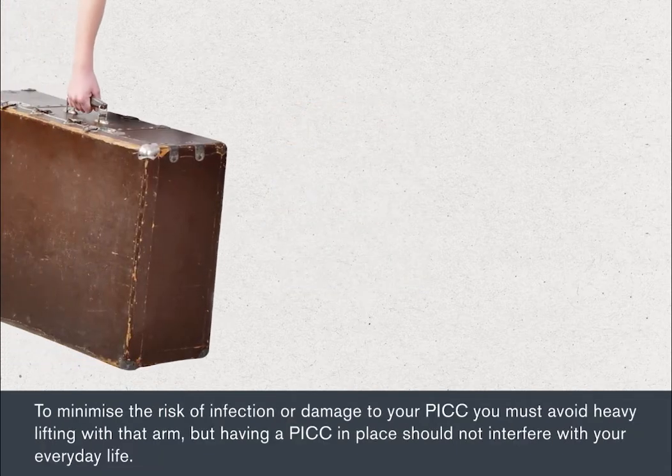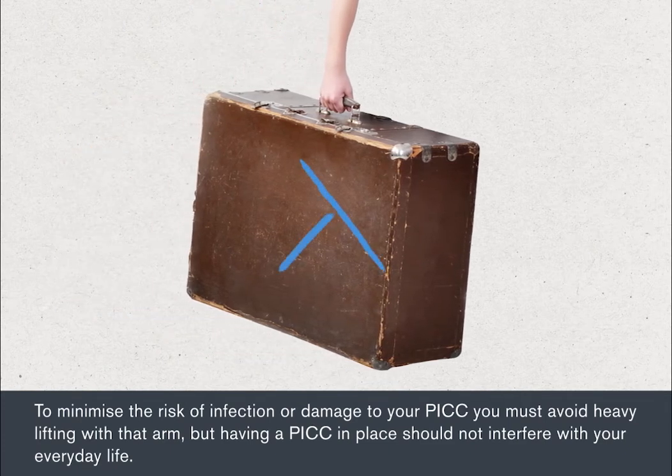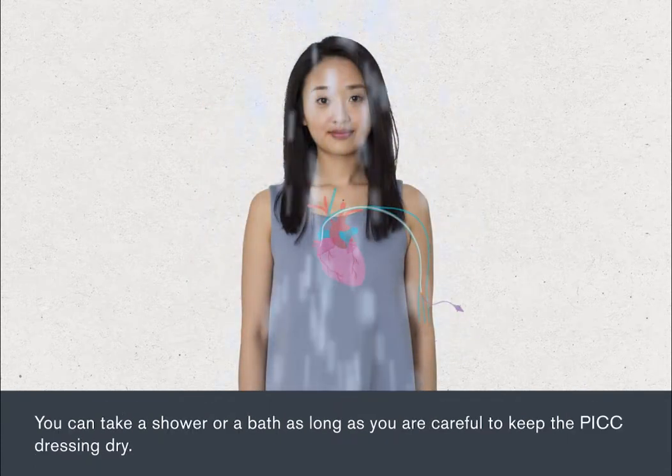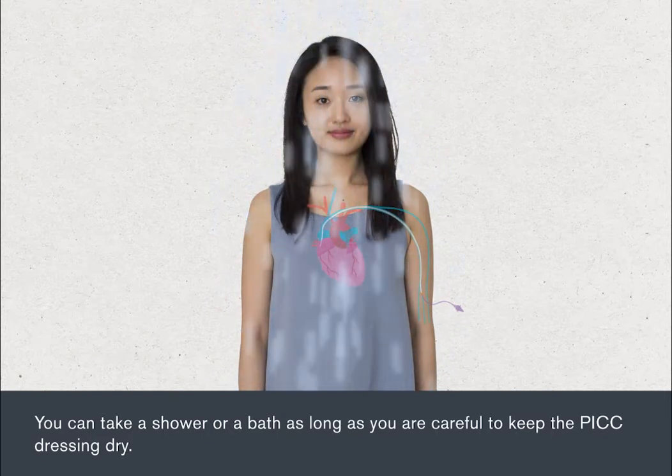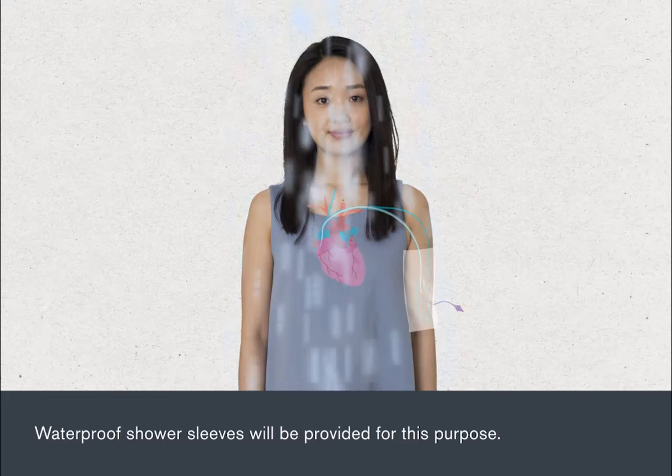To minimise the risk of infection or damage to your PICC, you must avoid heavy lifting with that arm. But having a PICC in place should not interfere with your everyday life. You can take a shower or a bath as long as you're careful to keep the PICC dressing dry. Waterproof shower sleeves will be provided for this purpose.